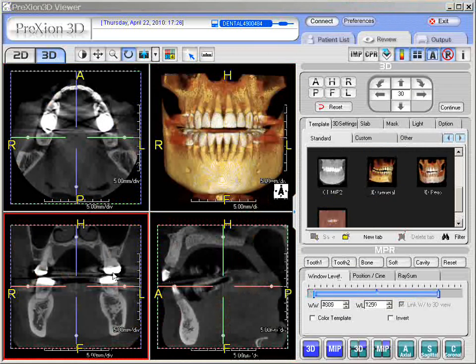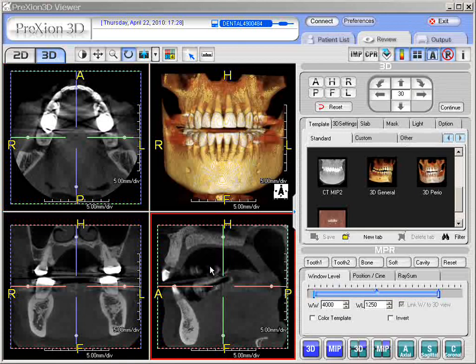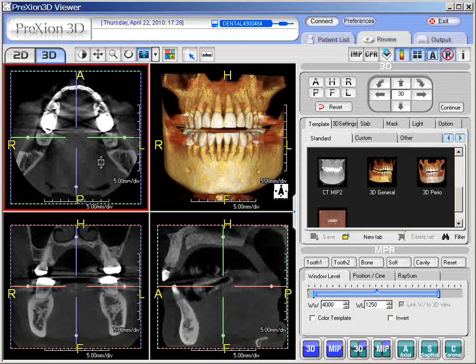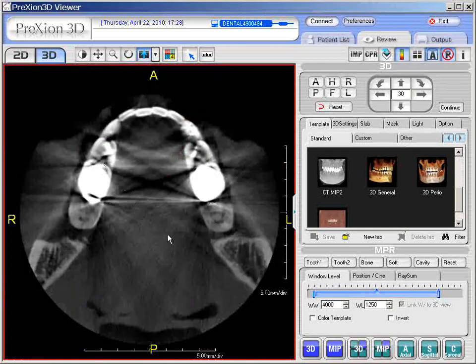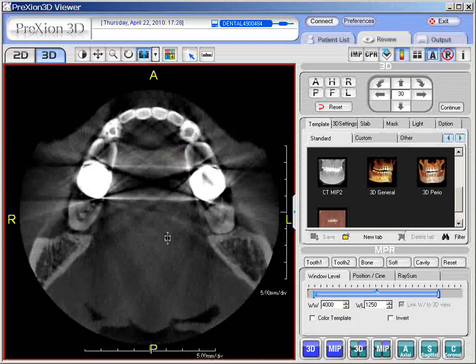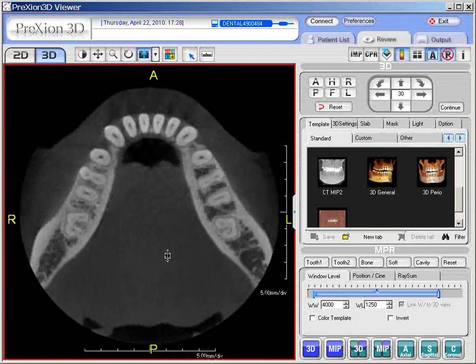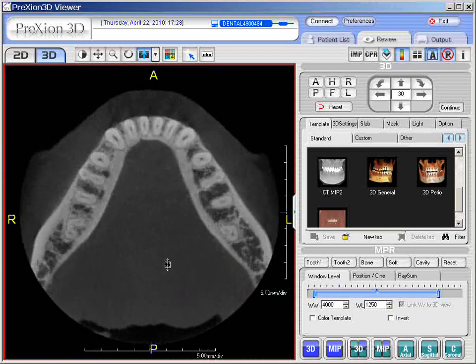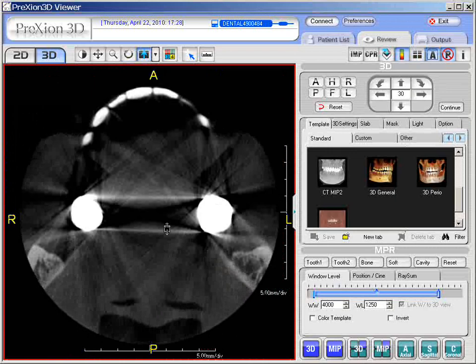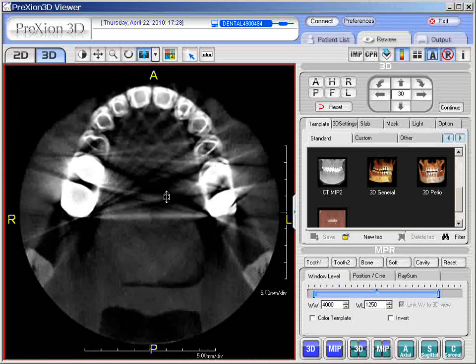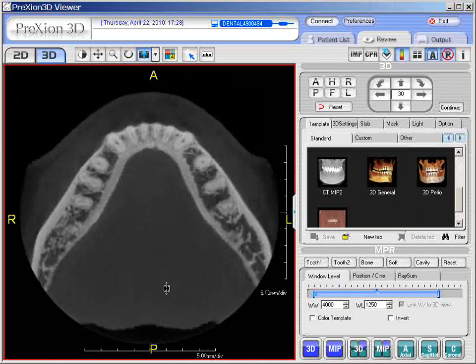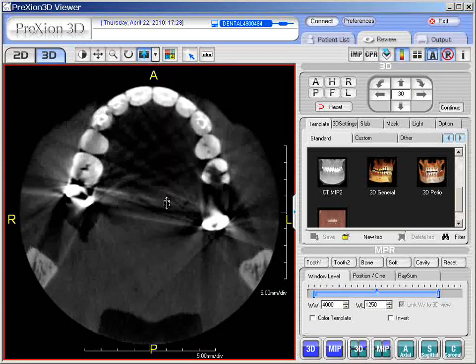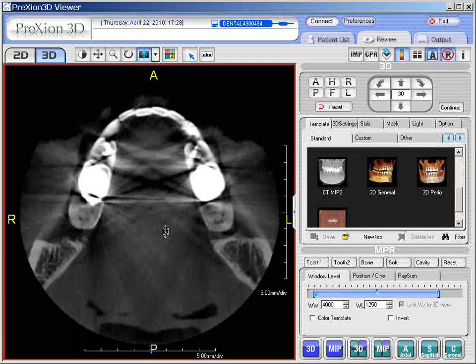Moving over to the CT images — axial, coronal, and sagittal screens. If we use the left click of the mouse and double left click to launch it in single mode, then hold the left click and move the mouse down or up, we are changing the slices. One can slice through the different images by just left clicking and moving.